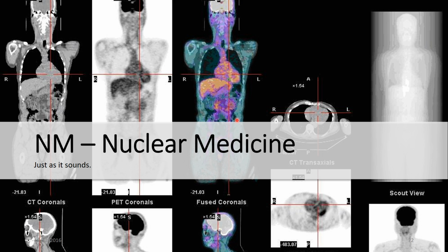The images are quite potato. So what you're seeing here is a CT scan, but then we can do SPECT CT or PET CT. It's just abbreviations for combining nuclear medicine and CT. CT provides the anatomical information, and nuclear medicine provides the functional information, and then they tie it together in these funky coloured pictures.